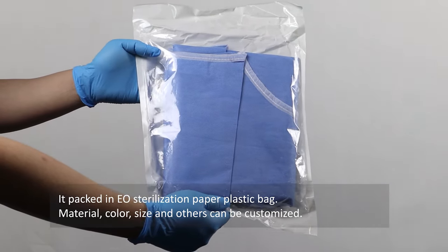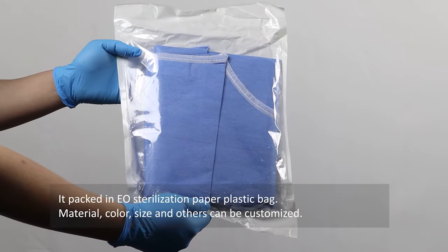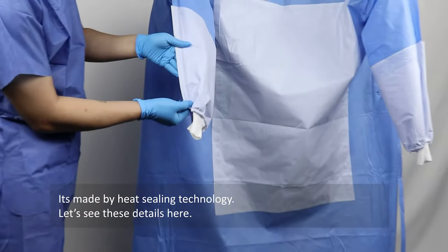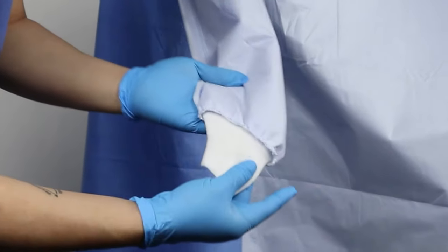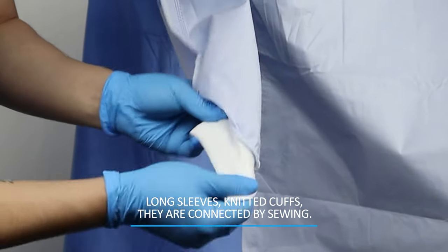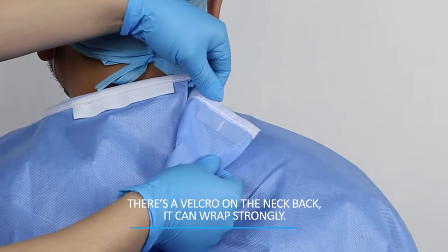It's packed in an EO sterilization paper-plastic bag. Material, color, size, and other options can be customized. It's made by heat sealing technology. Let's see the details: long sleeves, knitted cuffs — they are connected by sewing.